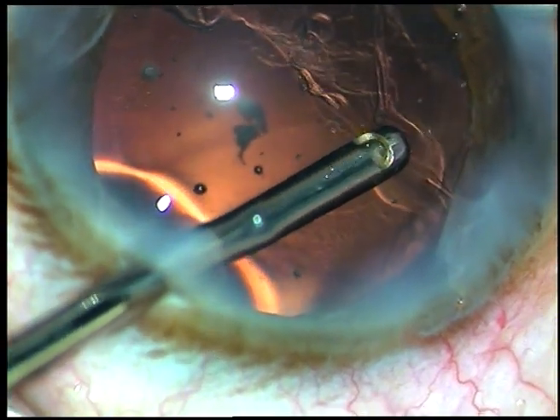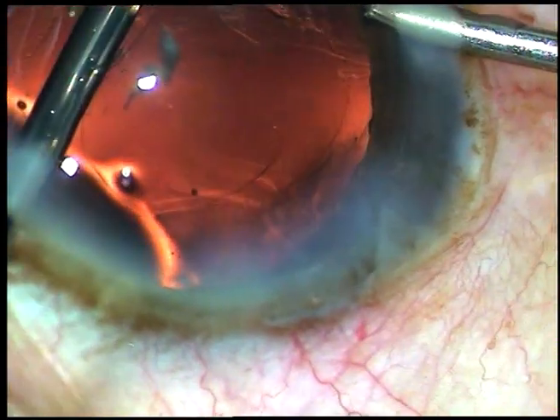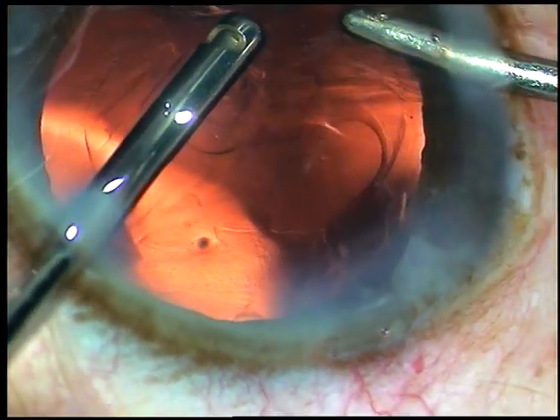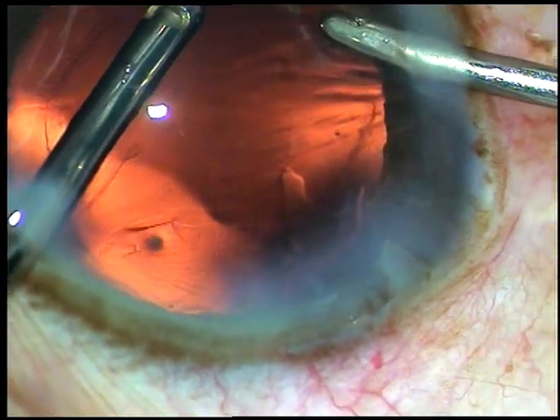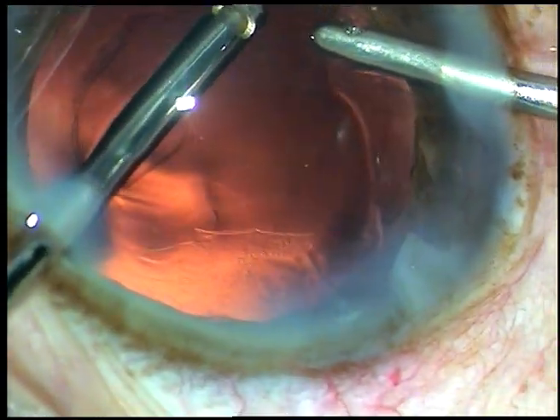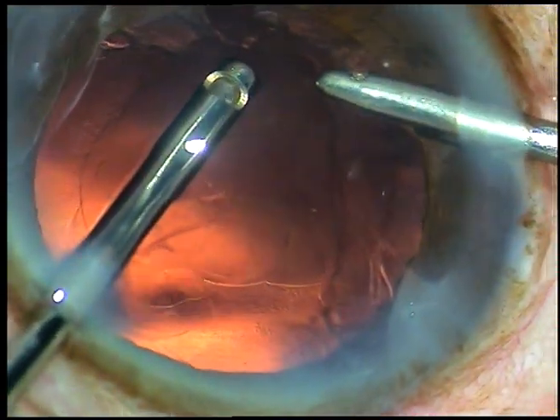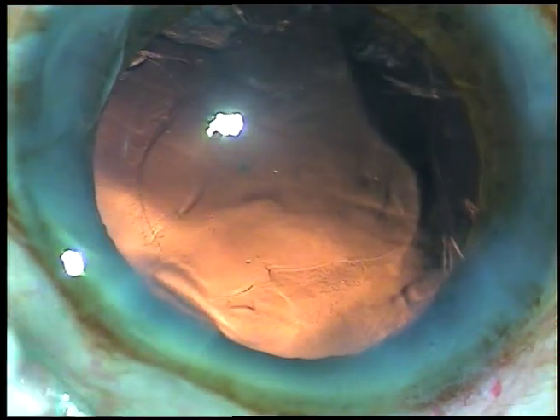I injected some viscoelastic and here I go with the cutter. This is the Accurus from Alcon — a nice vitrectomy system. The company has discontinued service to this machine, but fortunately the machine is still working. That is it.